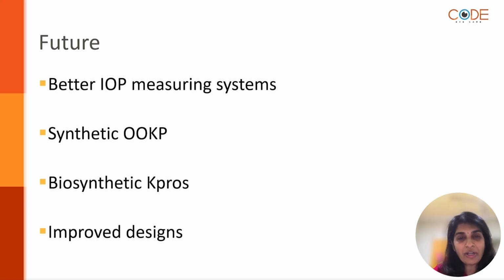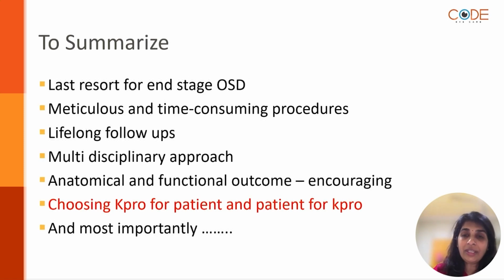And to summarize, what we need to remember and understand about K-pros is that this is the last resort for end-stage ocular surface diseases. These are meticulous and time-consuming procedures that require lifelong follow-ups. One needs to have a very high amount of passion and commitment towards the subject as well as towards these patients. It's a multidisciplinary approach wherein the anatomical and functional outcomes are very encouraging.